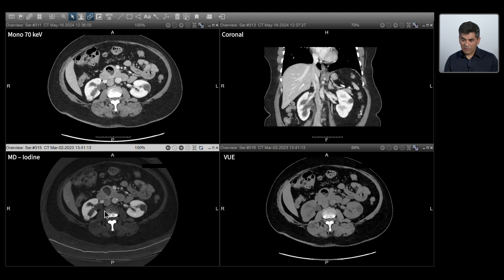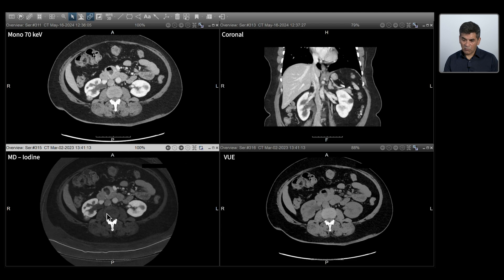When you look at the renal collecting system, which I was concerned about on the coronal images, we don't see any abnormal enhancement or nodularity — which is a good thing. That means this was just some high-density material in the urine, but not abnormal tissue.